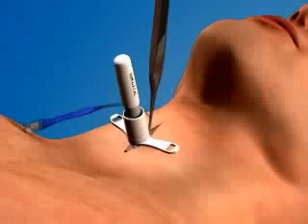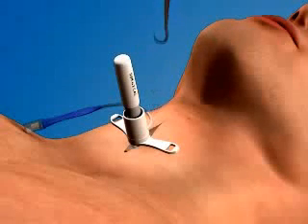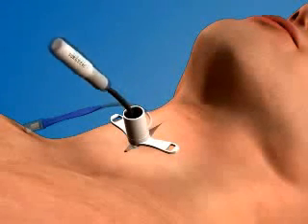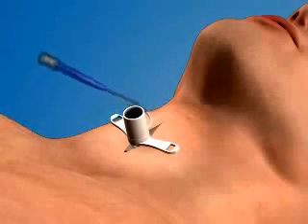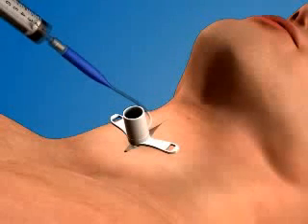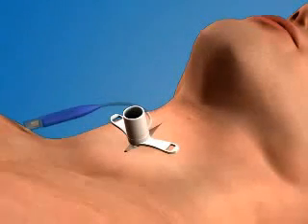Advance the airway catheter completely so that the flange of the device rests against the patient's neck. Once the tube has been fully inserted, you can remove the tracheal hook and the obturator from the airway catheter. Finally, inflate the cuff with air and begin to ventilate the patient with a bag valve mask.